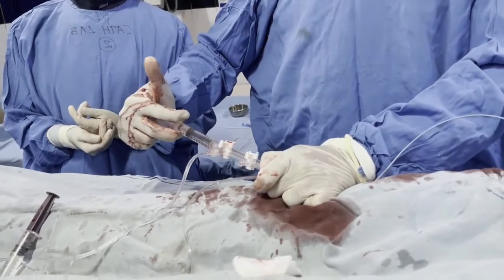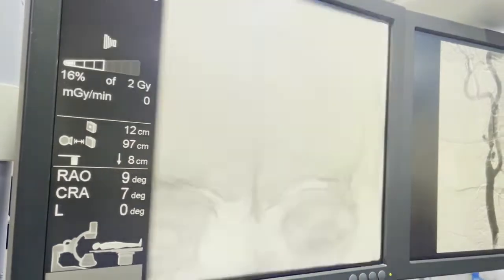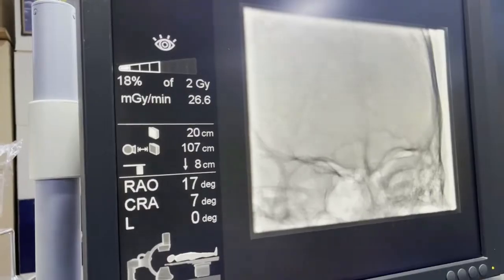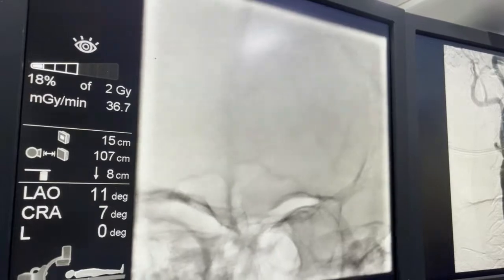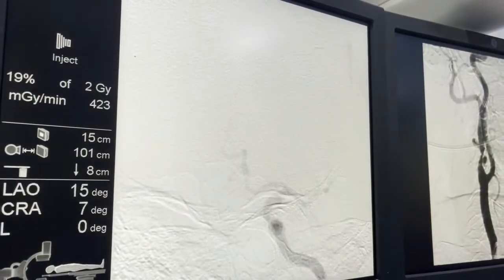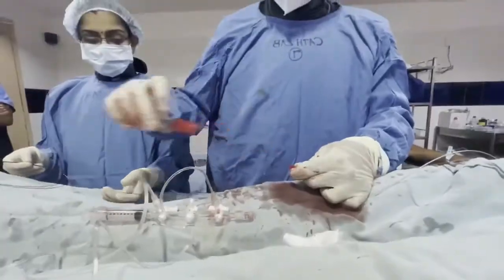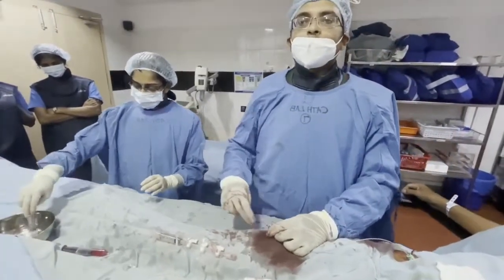I have given a test dose here, located the position, and am now injecting. In this patient, in the ACA region, I am suspecting some ectasia or abnormal swelling at the ACA beyond the A2 segment. I have to be careful not to miss any aneurysm, because aneurysms in a patient could be multiple. We found one aneurysm — a stenosis with an ulcerative dissecting aneurysm — but the patient could have multiple aneurysms, so don't miss it. I changed the position and did another DSA focused on the ACA segment, and found that it was not an ectasia or aneurysm but actually a folding of the ACA artery. I am relieved it is not a second aneurysm.